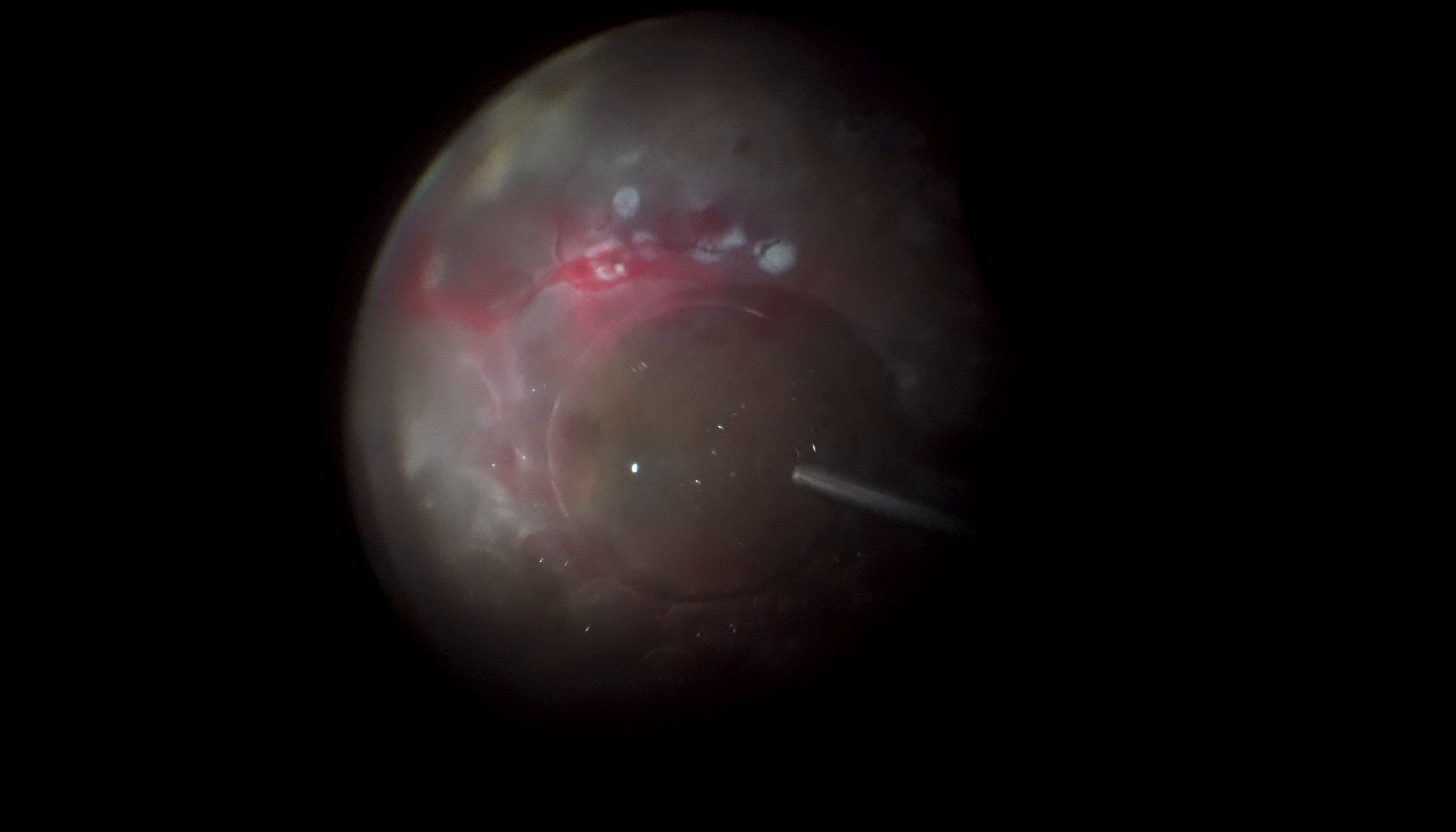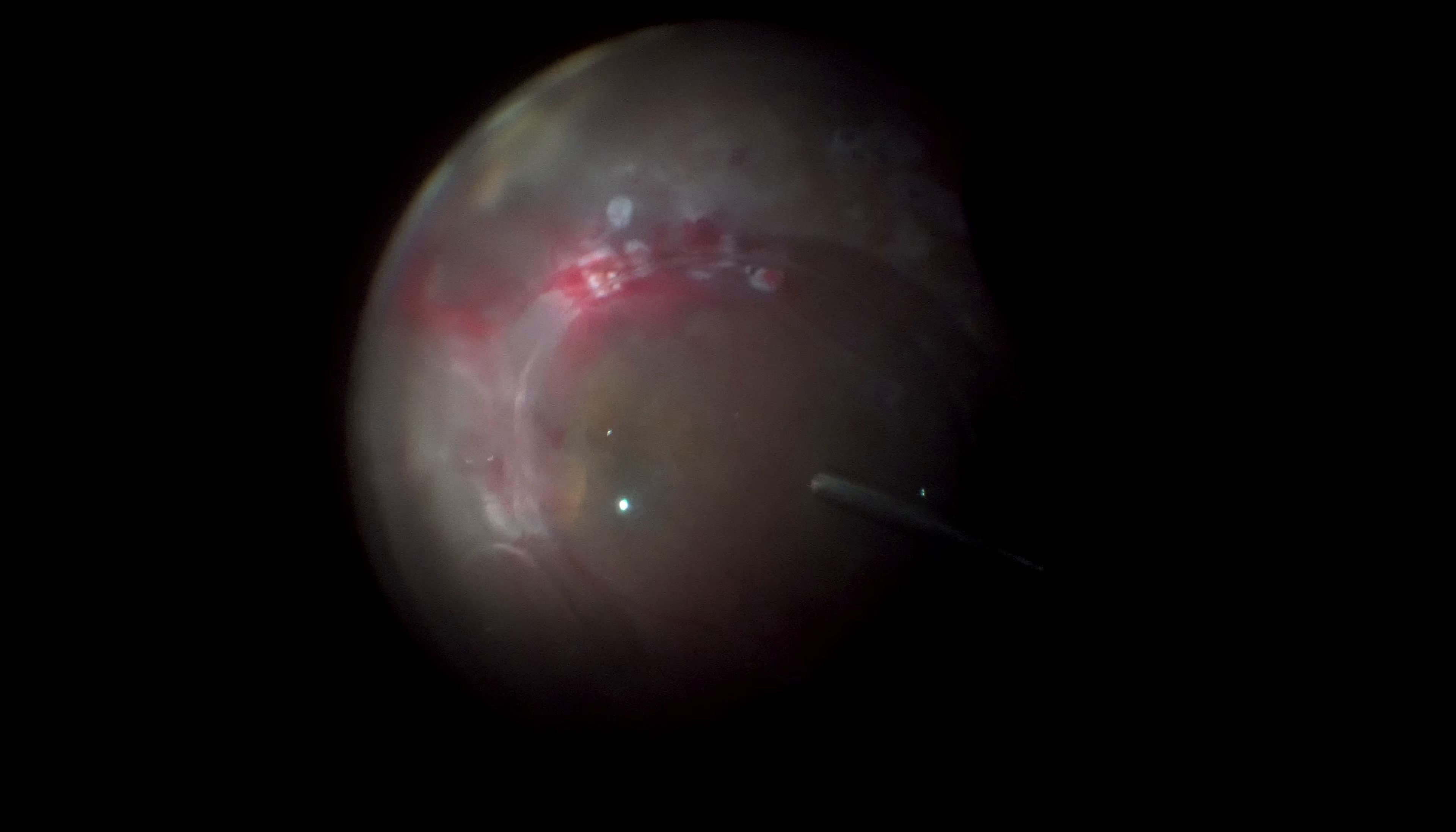It is always important to feel the retina when you touch it. Perfluorocarbon liquid is injected with a fourfold purpose: to halt leaking vessels, to stabilize the retina, to avoid retinal rotation since it is tractionally detached, and to create a medium for good laser uptake while mechanically pushing the retina downward. Perfluorocarbon liquid should be injected up to the ora serrata to cover all the macula and peripheral retina.